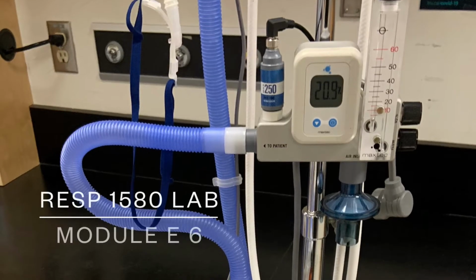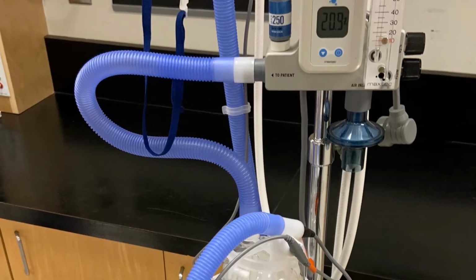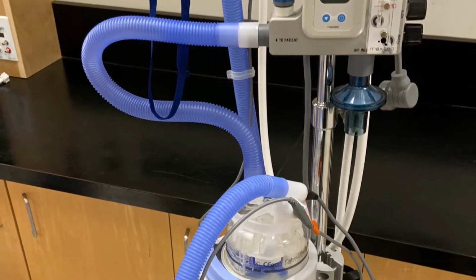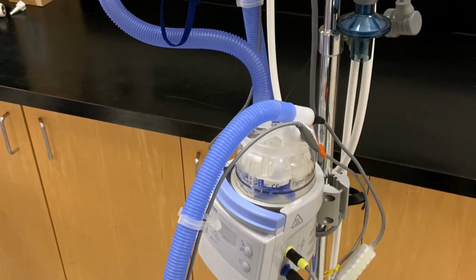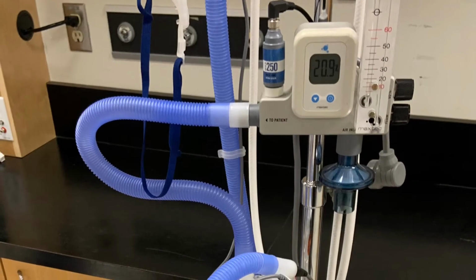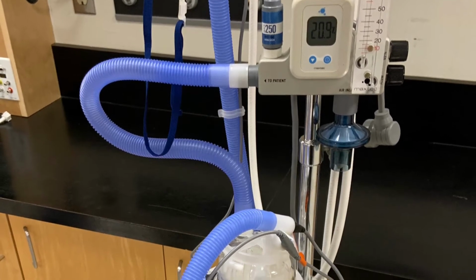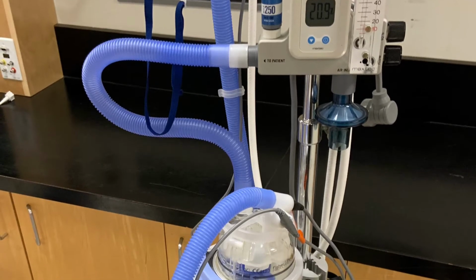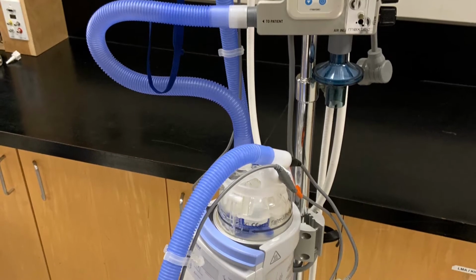In the RESP 1580 Lab Module E6, we're going to look at setting up the Optiflow high-flow nasal cannula system, and we're going to look at what factors affect the oxygen percentage delivered by this system. Even though this system looks complicated, it's really just a blender with a tube that delivers gas to a heated humidifier, and then gas picks up heat and humidity there and then flows out to your patient.